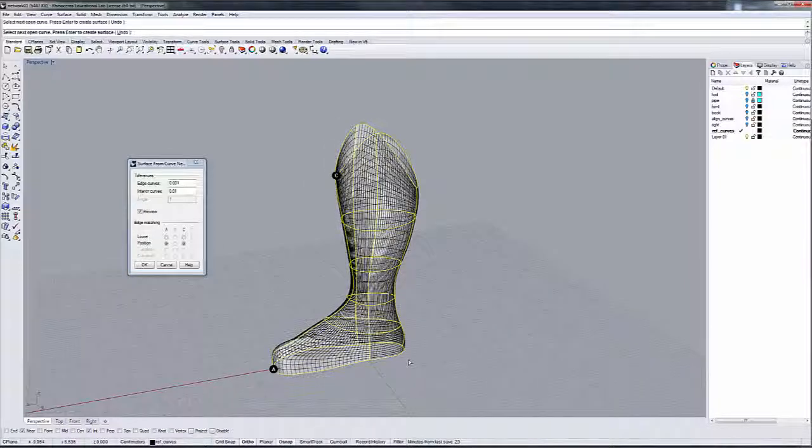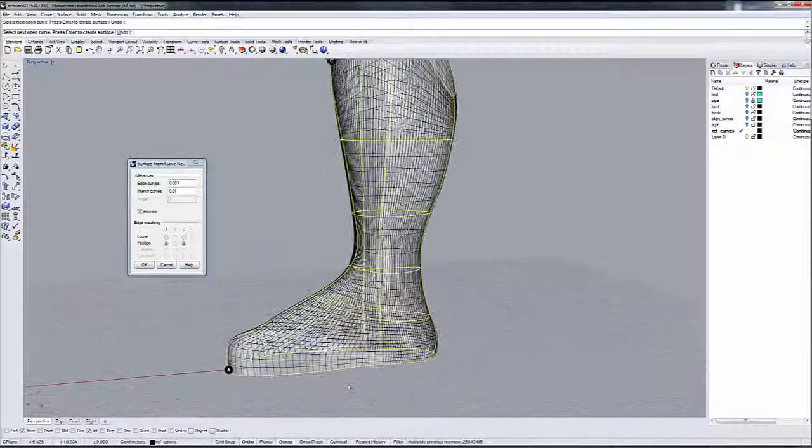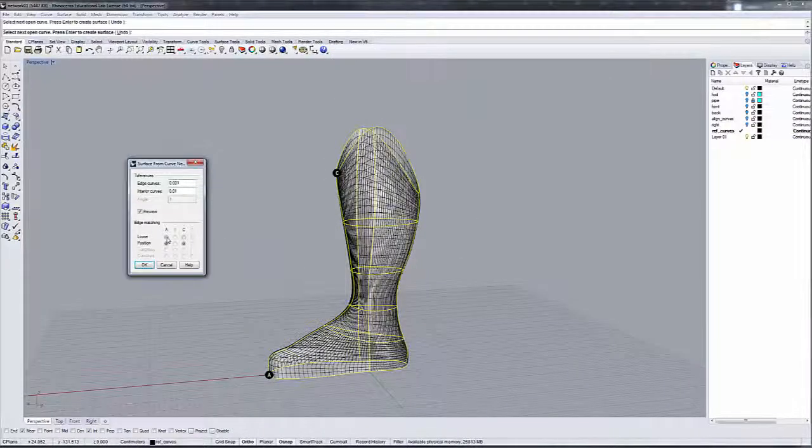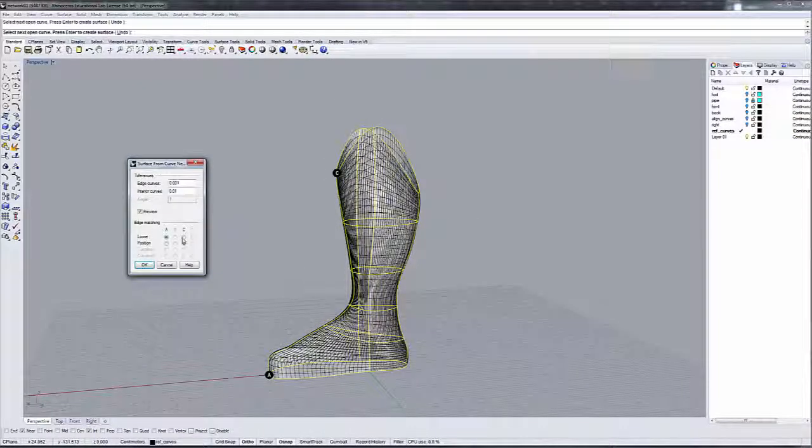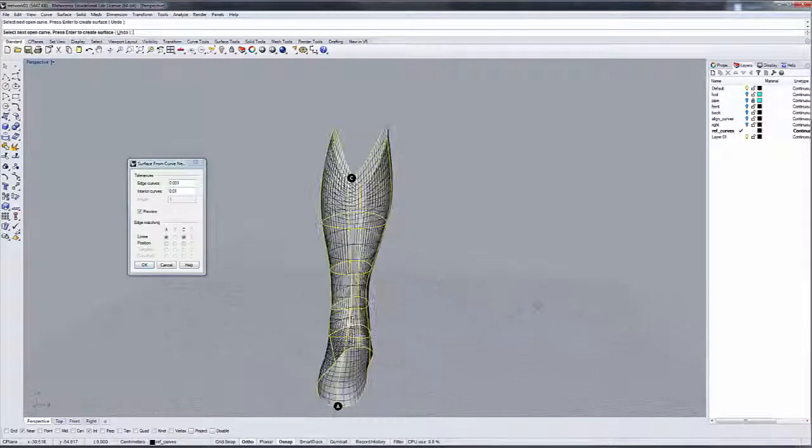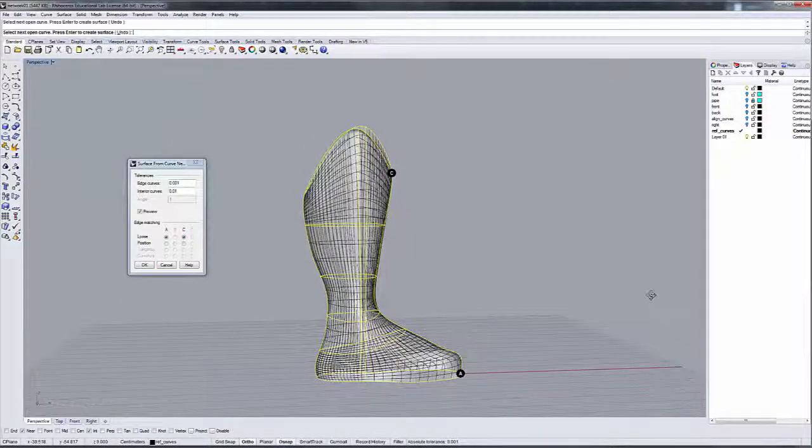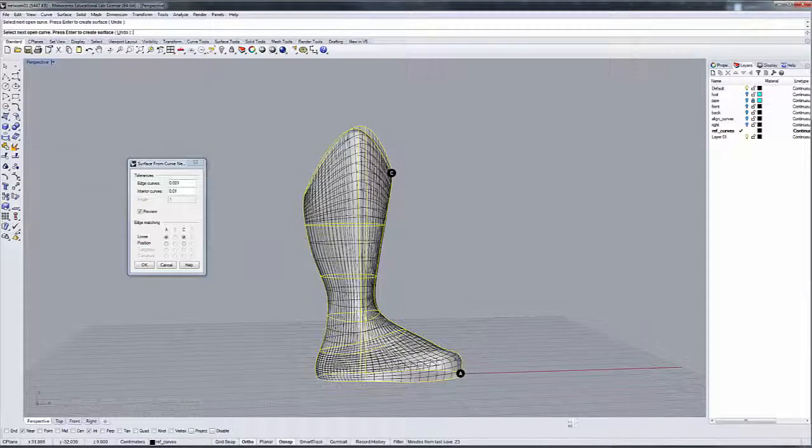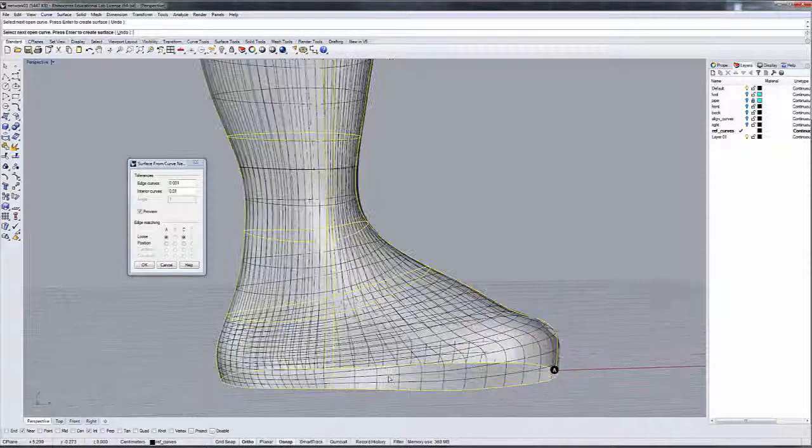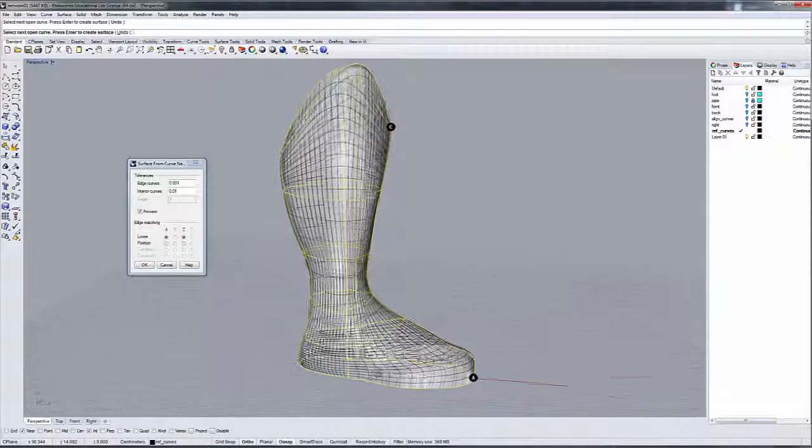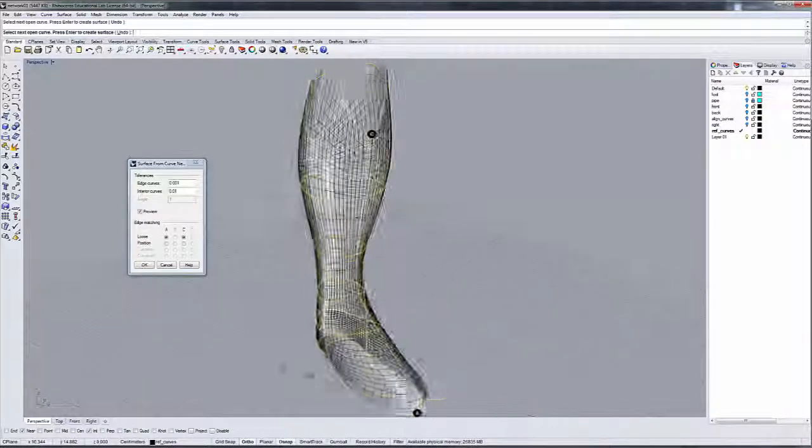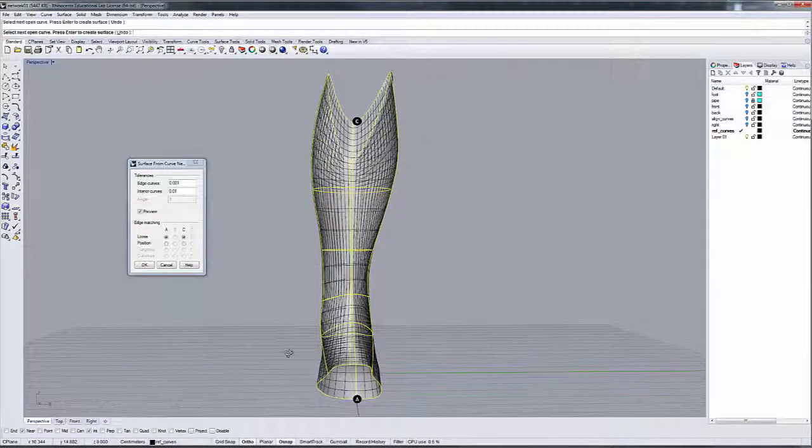Right now we have two types of edge matching that we could do. We have positional tangency here, and we could move it up to loose, and that's more loose. With positional, it usually goes through each one of the curve edges. With loose sometimes it doesn't. But this gives us the general shape of our curve.